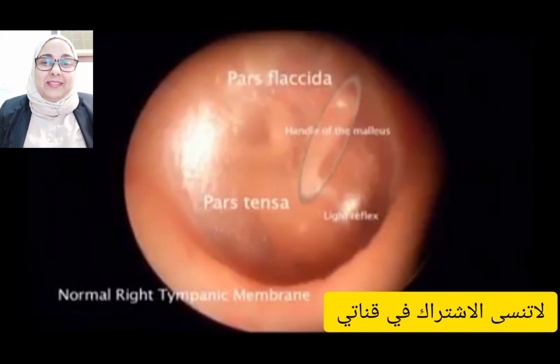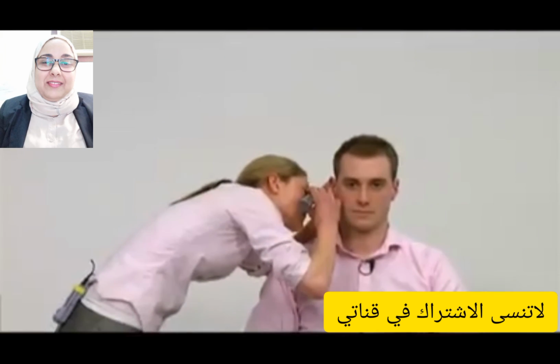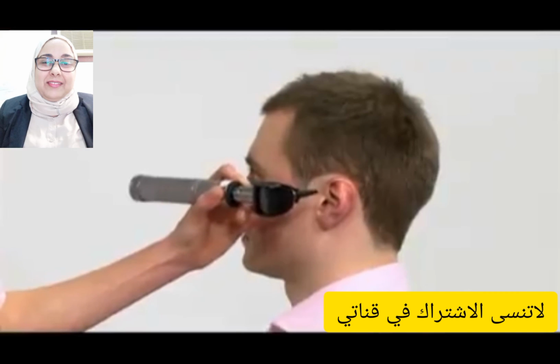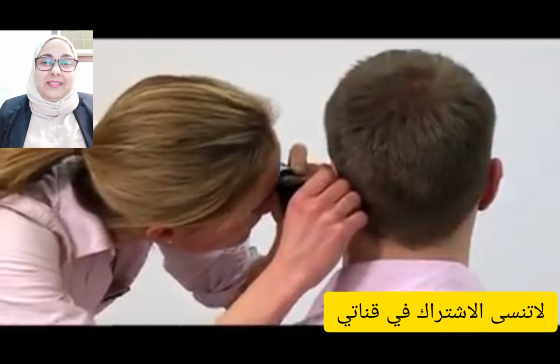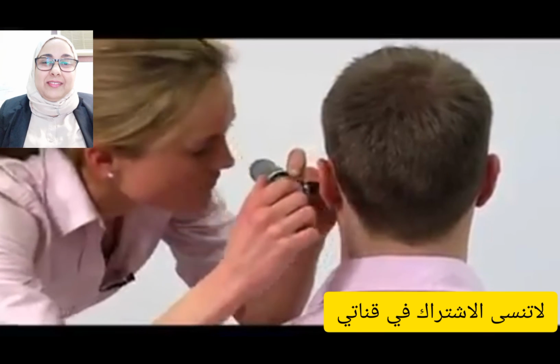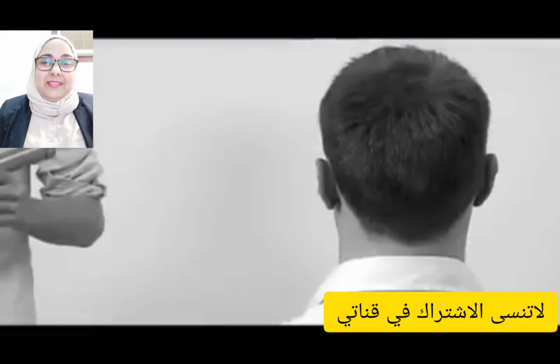Gently remove the otoscope, continuing to observe the ear canal for any pathology that may have been missed on the way in. Repeat the examination on the other ear. When examining the left ear, hold the otoscope in your left hand, again holding it like a pen between your thumb and index finger, and using your little finger to rest against the patient's cheek. To complete the examination of the ear, the patient's hearing should also be assessed using the tuning fork tests and audiometry.